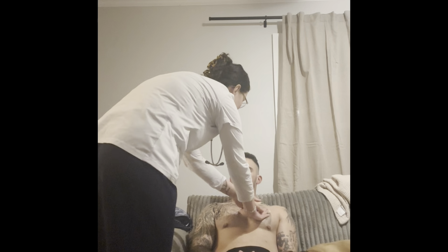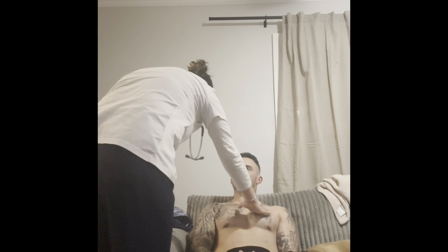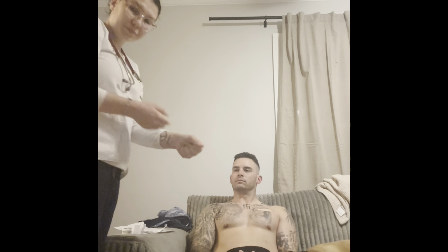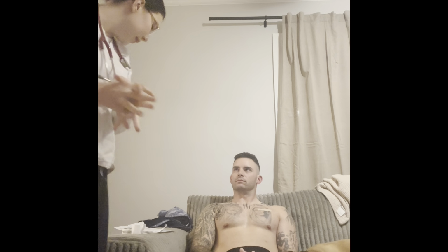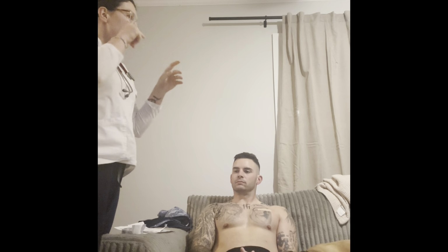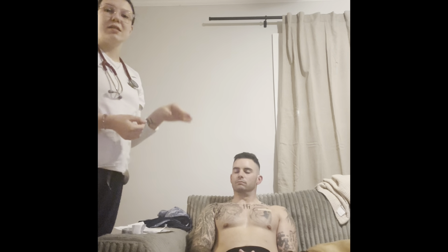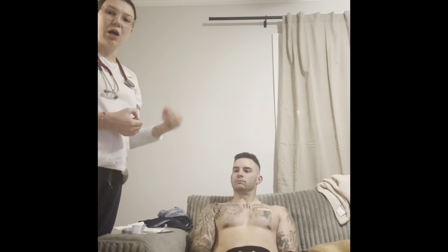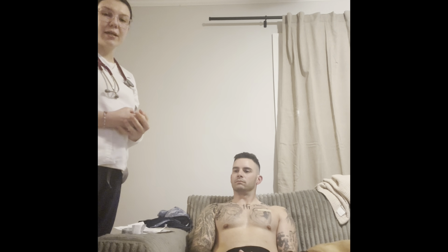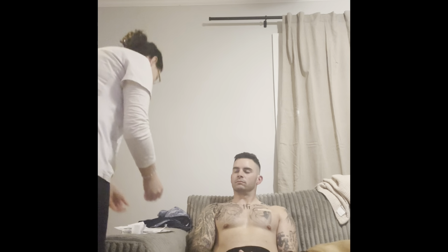I want you to take it off just like that, one side of it first, then the next, and then press and hold firmly for 15 to 20 seconds. All right, I'm gonna go ahead and take off my gloves. I'm gonna perform hand hygiene again, and then I am going to wait a few minutes, wait for the drug to take effect, and then I'm going to reassess his pain level, make sure that he's tolerating the drug well, maybe redo vital signs as well to make sure that he's still well within normal limits to be continuing to receive the dosage of the fentanyl patch.